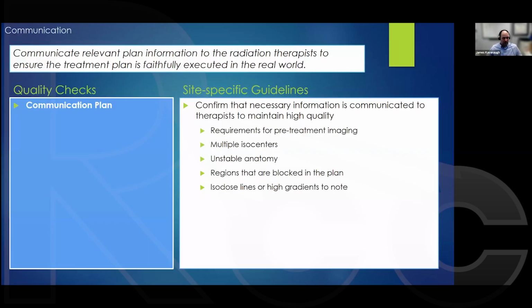So communication, this is a pretty standard slide. I think you've seen it in others as well, but it has its own slide for a reason. Treatment planning is complex. Thirty years ago, physicians would be at the sim, do their field placement, calc the plan, and move on, doing all of it. And our physicists would be double checking.